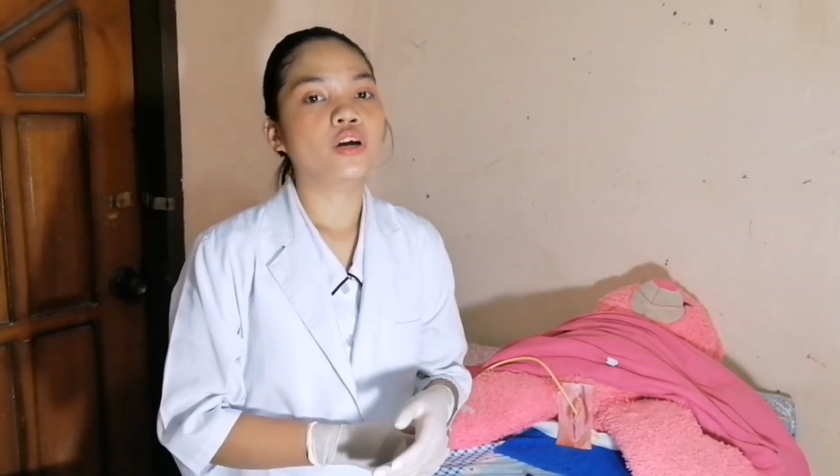The next procedure is to place the client in a comfortable position and do aftercare of other equipment used. Remove gloves and do hand washing.